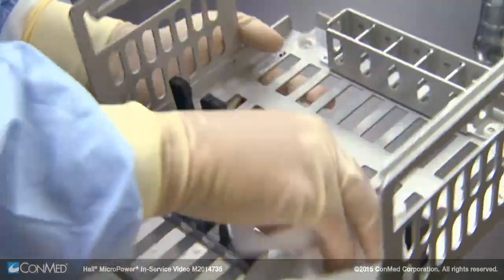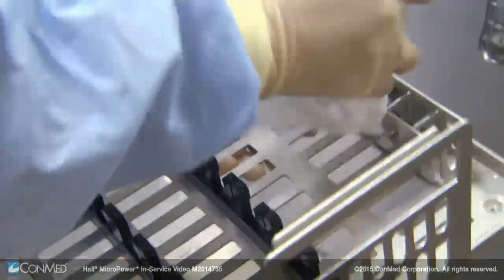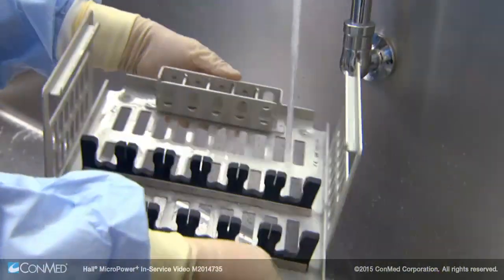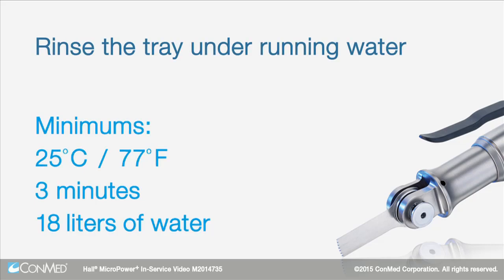Thoroughly clean the tray by wiping with a clean, soft, non-abrasive cloth dampened with a neutral pH balanced detergent. Rinse the tray under running water with a minimum temperature of 25 degrees Celsius or 77 degrees Fahrenheit for a minimum of 3 minutes using a minimum of 18 liters of rinse water.